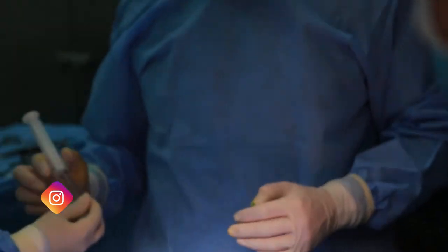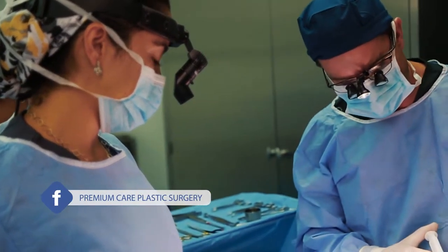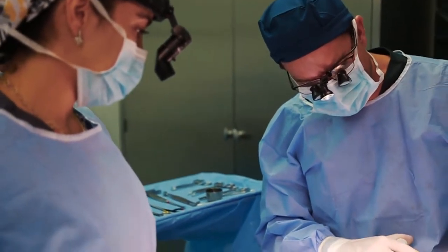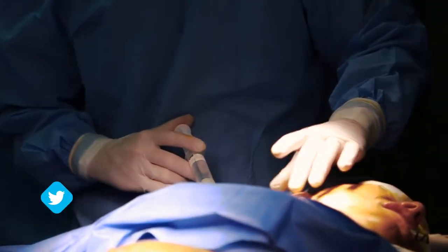We are going to do a facelift. The nice thing is we don't have to do a huge dissection because she doesn't need as much lift as if I was doing this in 20 years or so. We are also going to do a buccal fat pad resection to reduce some volume in her cheeks and try to bring out some thinness in her lower face.